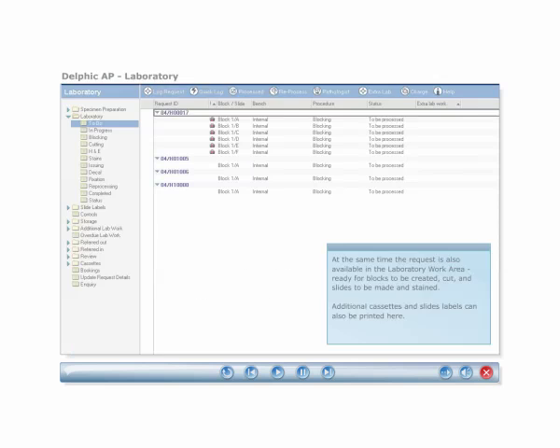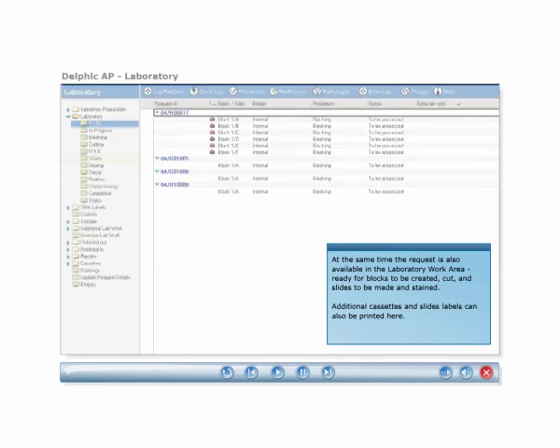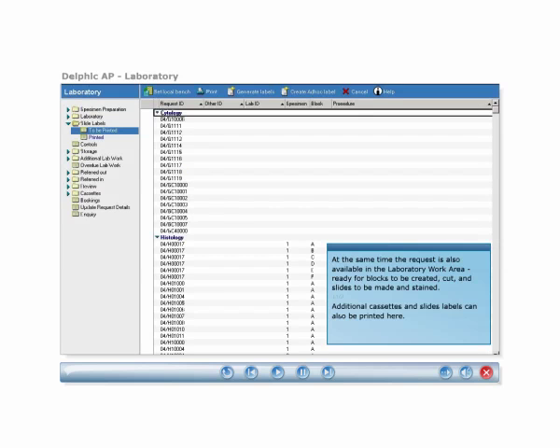At the same time, the request is also available in the laboratory work area, ready for blocks to be created, cut, and slides to be made and stained. Additional cassettes and slide labels can be printed here.